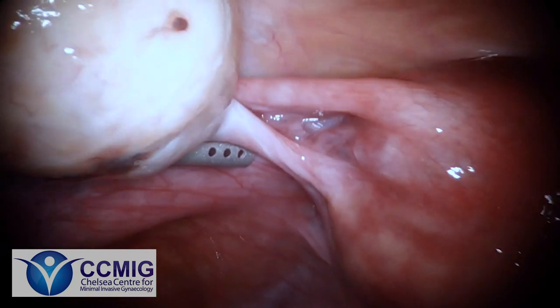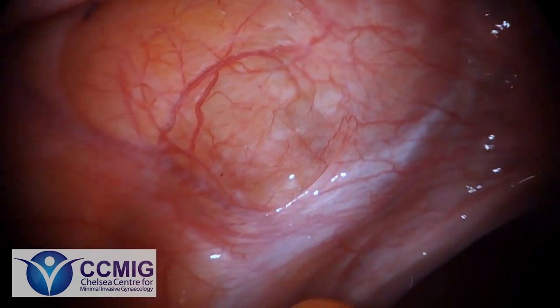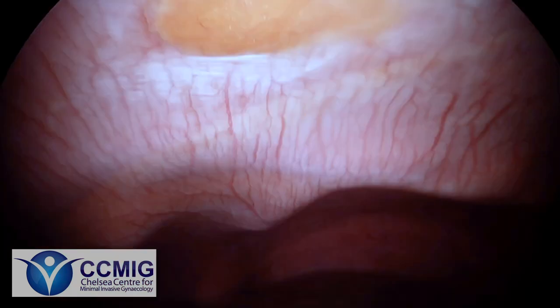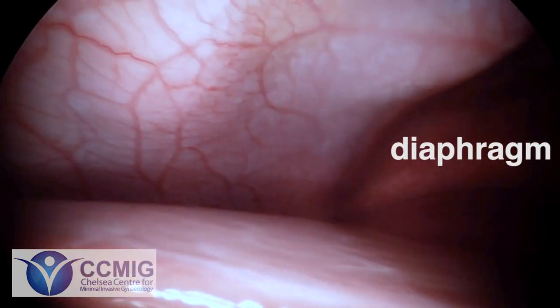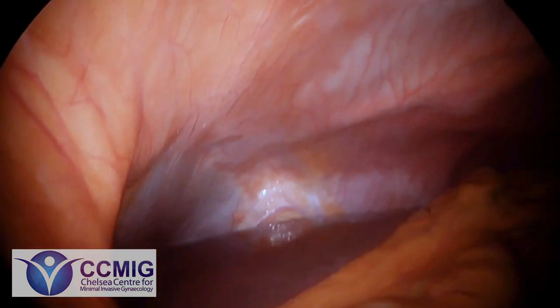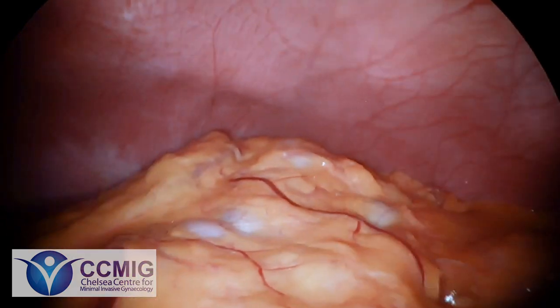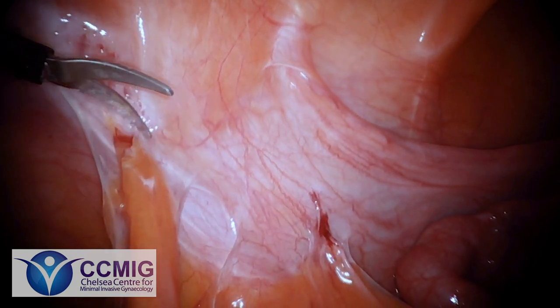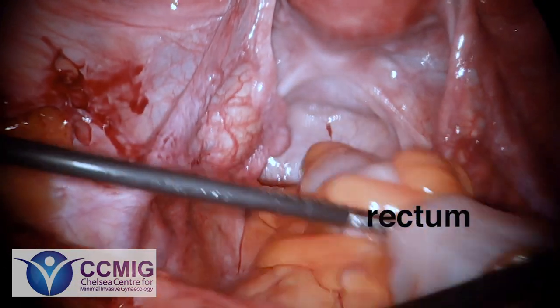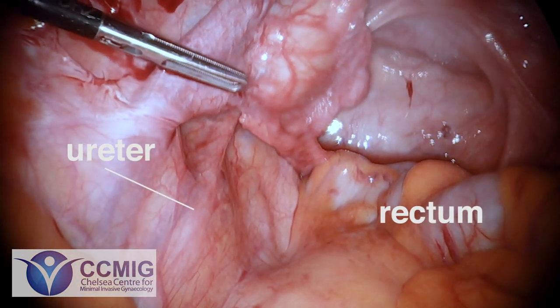The diagnostic laparoscopy is a very systematic survey and now we're going to look at the upper abdomen. Here you can see the gallbladder, the liver and the bowel. The diaphragm importantly divides the abdomen from the thorax — the chest cavity — and it's also a place where endometriosis can live. People with diaphragmatic endometriosis often have symptoms of shortness of breath or sometimes collapsed lungs when they have their period. The heart lives very close to the diaphragm, more towards the left hand side, and you can see the heart pulsations carried through into the abdomen. Here we are freeing up the bowel from the left hand side of the abdomen — this probably wasn't as a result of endometriosis but we need to move it out of the way to have a good view. The rectum moves really freely and we can see the ureter nicely on both sides.